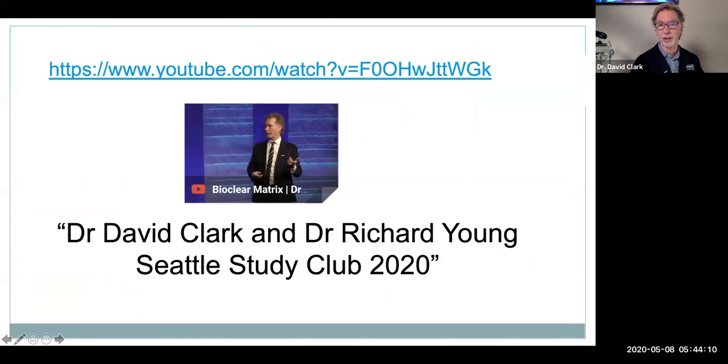So basically, this is our dental community. One of the things I keep putting up: if you can go to YouTube and watch the summary of the Bioclear method, it's about 40 minutes. It wraps up the whole thing, anterior and posterior, talking about compression versus tension, and how the composite in the Clark Class 1 and Clark Class 2, with the polymerization shrinkage and low C factor, actually lets the composite shrink around the tooth and put the tooth into compression. All of the things that were kind of fighting us to do composite, when you change the Venn diagram, now they all work together. Instead of working against the composite, we're working with the composite, but everything has to change.